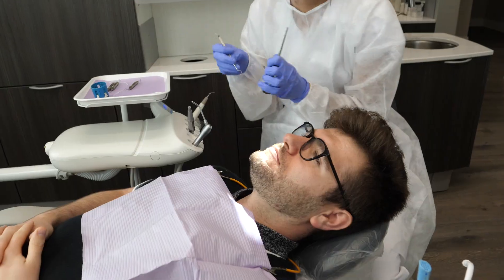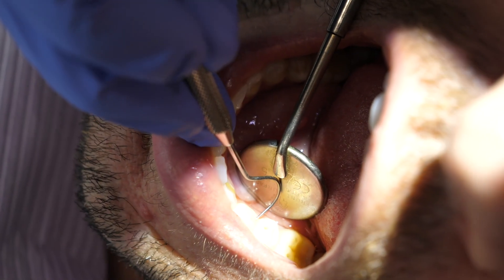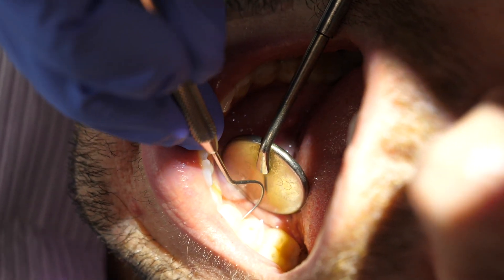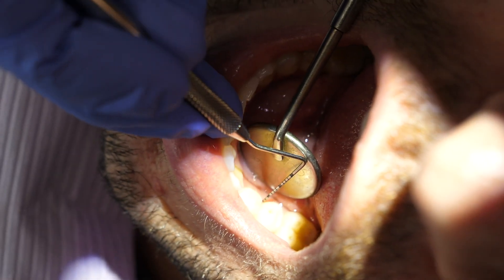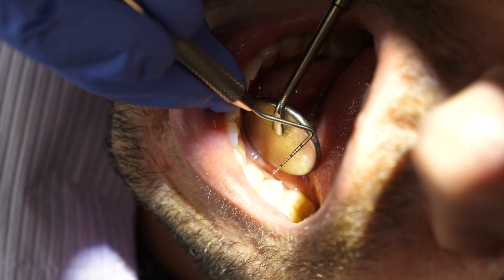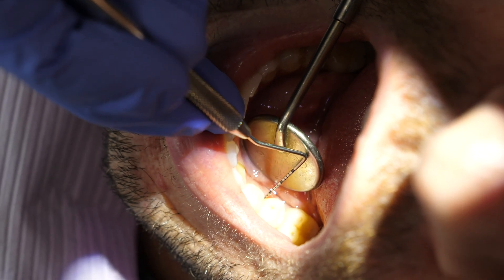So then I go back in with my explorer and air to see if I can actually view it clinically or feel exactly where it is. If you're still having trouble and you know something's there but can't figure out where, you can even use the probe end of an explorer to feel for it. The probe is sometimes longer than explorers, so if you're dealing with a really deep pocket, you can use your probe as an explorer.